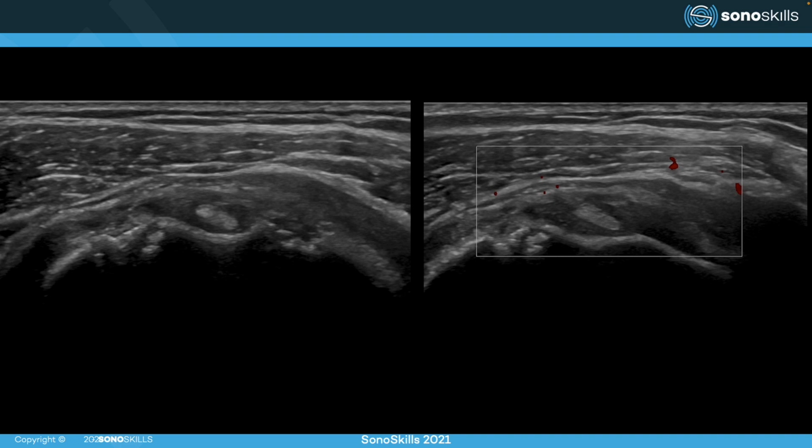The biceps is frictioning over the humeral head, causing erosion of the bone, and this is not a good sign, and this is called a chondral print sign. So if you're testing the rotator interval actively, you will see that the biceps needs to be following the movement of the humeral head, and if not, if it goes in the opposite direction, it causes erosion to the bone. So definitely check that as well dynamically.